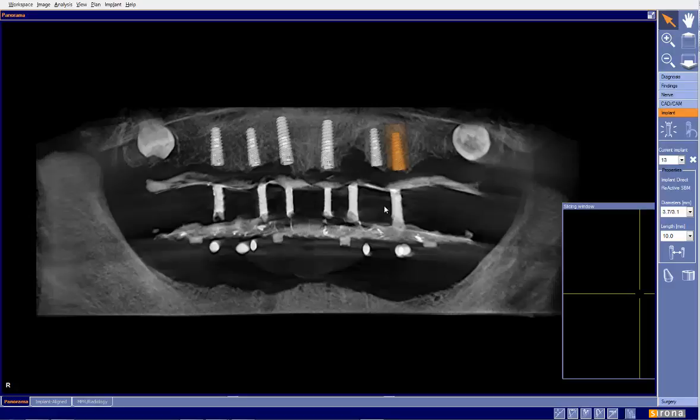So one of the things that is necessary when using a smaller volume such as the XG3D is to position the patient properly. Position the patient so that we miss this part of the jaw right here, and these 4, 5, 6, 7, 8, 9, 10 millimeters here are added up here into the sinus area. So that would be number one, of great help.